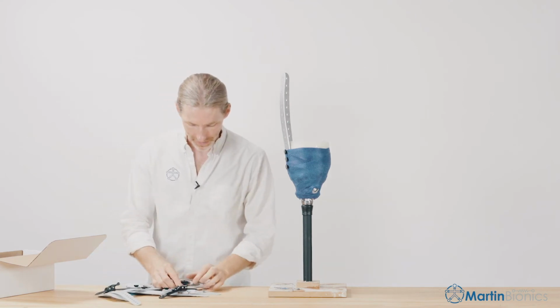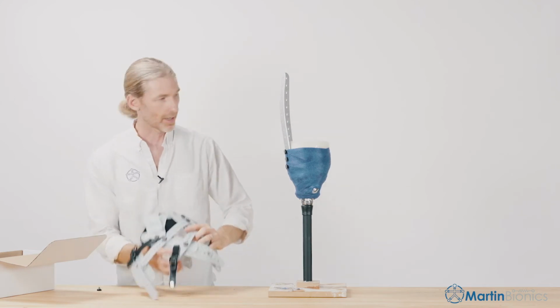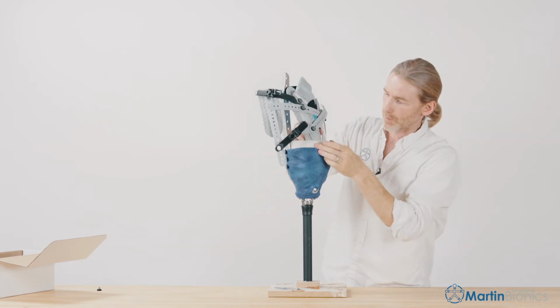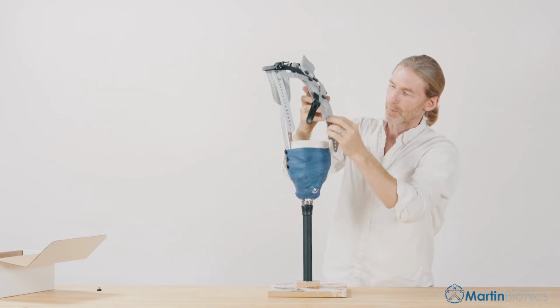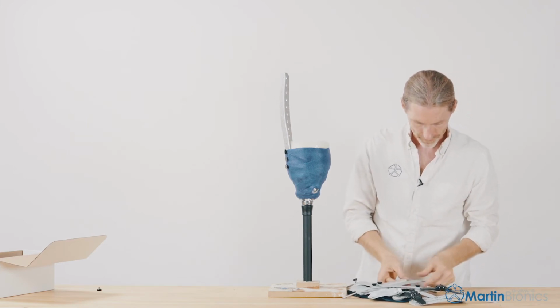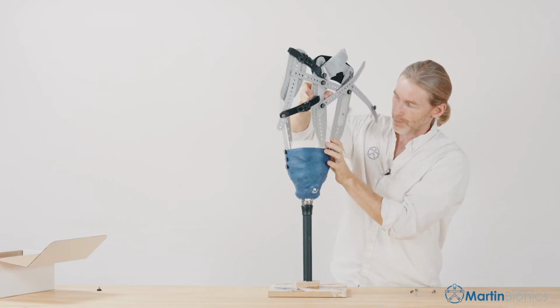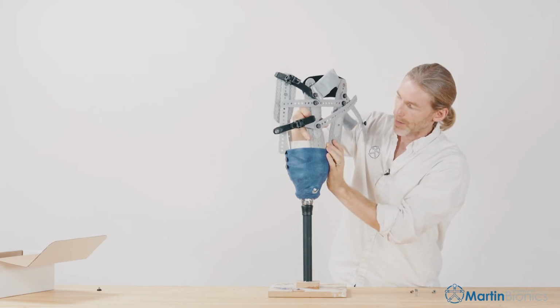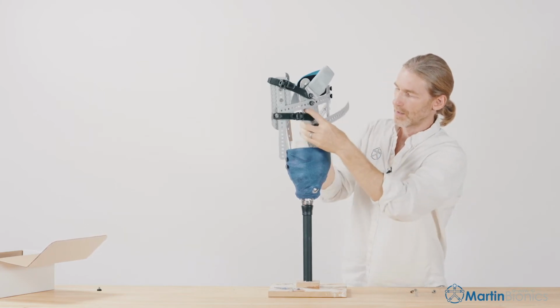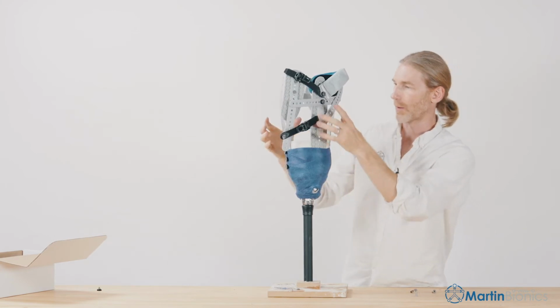So I'm going to go ahead and disconnect the bottom cross connector and get these lined up right where I want them. I know that on Tom, our length is going to be right at the full length. So I don't have to cut the struts, although if you need to cut them, it's simple to cut them to length. I'm going to slide my air hammock pedals down in between. These are going to be long, I'm going to need to cut them. But positionally, I want to find right where I want them to sit.